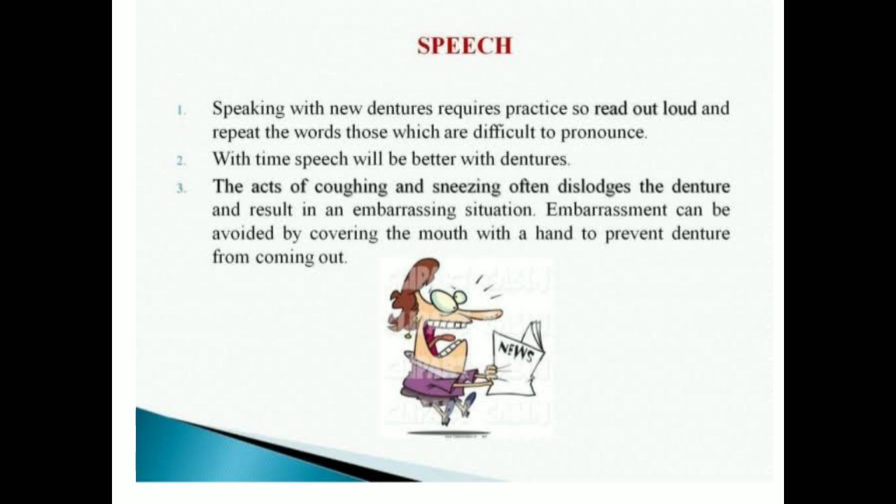Then what happens to his speech? Initially there might be speech difficulties. They can pronounce some words, but they cannot pronounce some words properly. They will feel some difficulties. In Telugu they can say మాట్లాడేటప్పుడు తుస్సుమంటున్నాయి. The patient complains like that because there will be a problem, right?